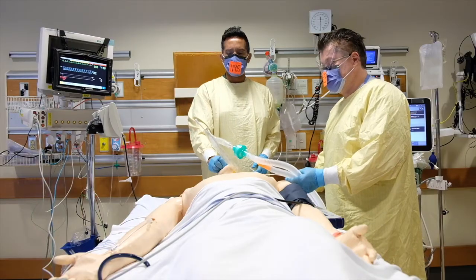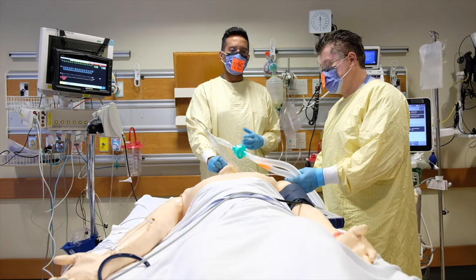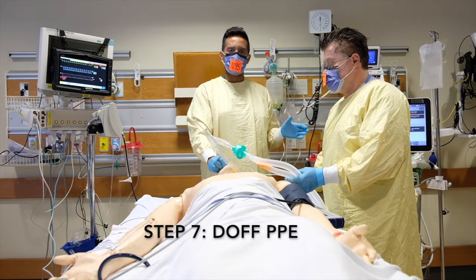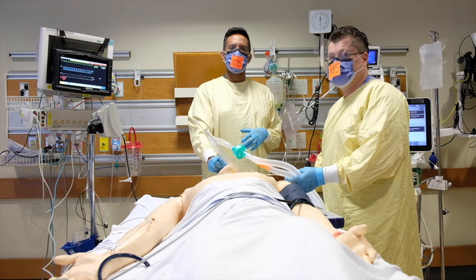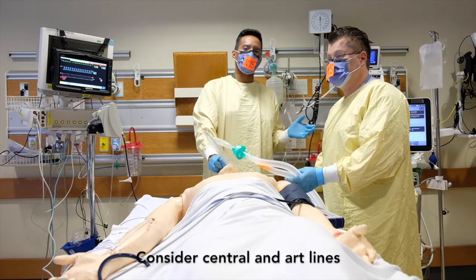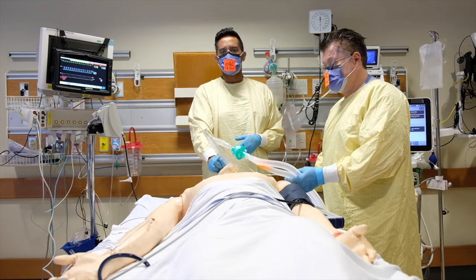After you've successfully intubated the patient, ensure that you've secured the tube. It is very important that as healthcare providers leave the room, that they appropriately doff, which is the number 1 time when healthcare workers get contaminated. And we also do suggest that while you're in the room once, you should probably put the central lines and arterial lines in during this time rather than leaving the room and coming back in. So it is ideal to have all that equipment ready to go prior to intubation.